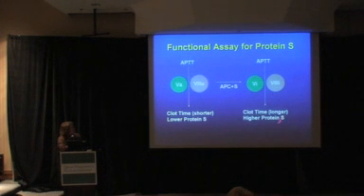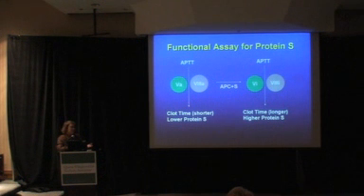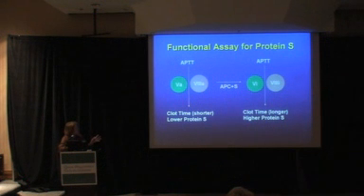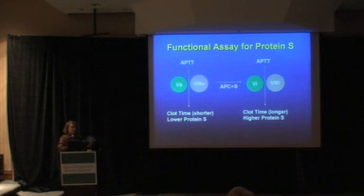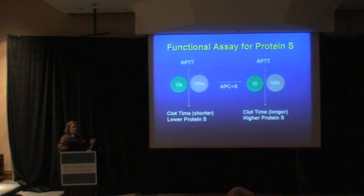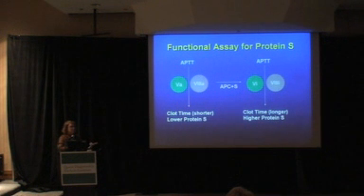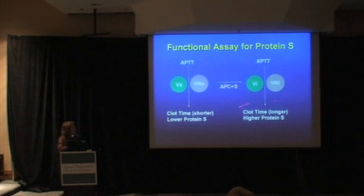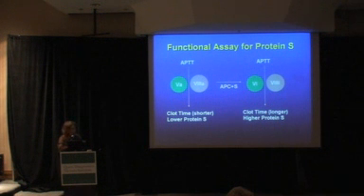A longer clot time in the assay is associated with a higher protein S. So anything that makes your clot time longer will make it look like your protein S is higher. High levels of heparin, direct thrombin inhibitors, and lupus anticoagulants can mask a protein S deficiency and make it look like your protein S is high.